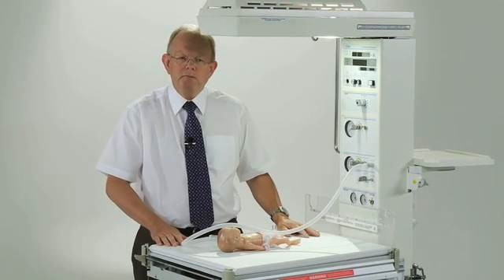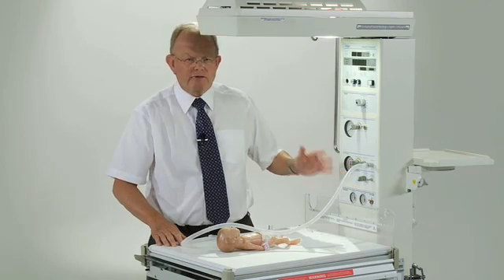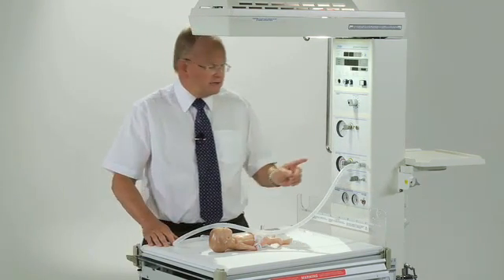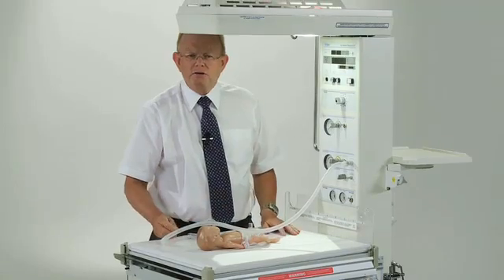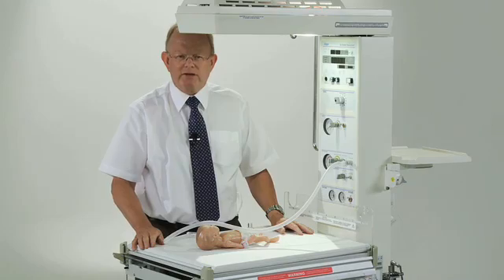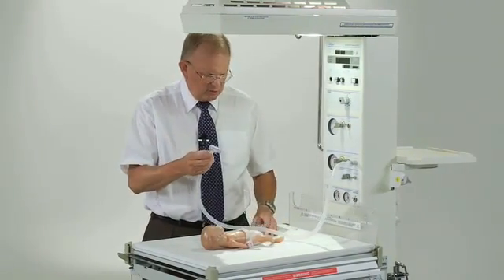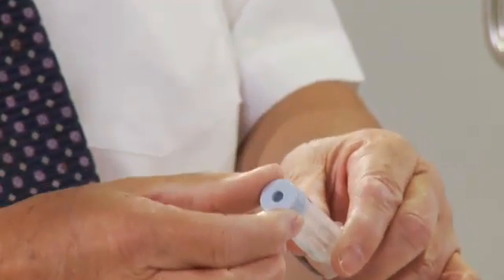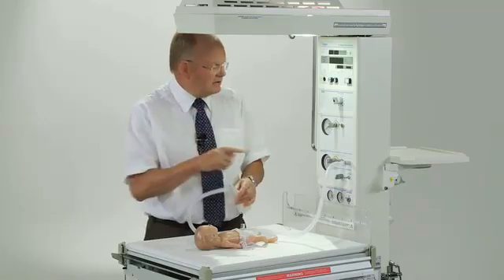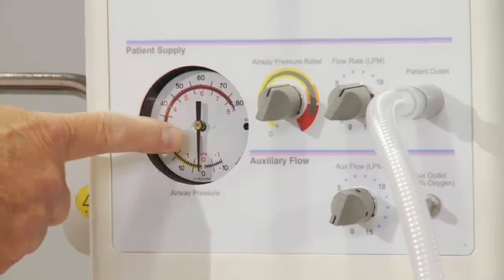I'm now going to tell you about the component parts of the T-Piece resuscitation device. First of all it needs a gas supply coming either from the wall or cylinders. The flow of gas into the device is set by adjusting it here, and that should be a flow of somewhere around 8 to 10 litres a minute. The gas then flows through this tube to the T-Piece device, which can be attached to a face mask or to an endotracheal tube. The PEEP or CPAP pressure is adjusted by altering that knob, and the peak inflating pressure is adjusted from here. The pressures being delivered are seen on this dial here.